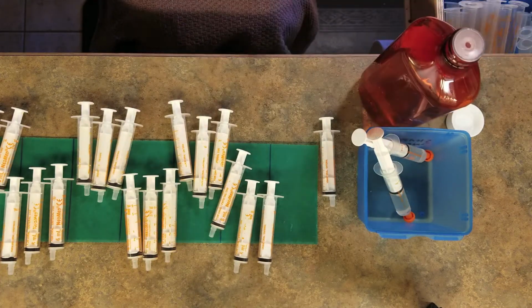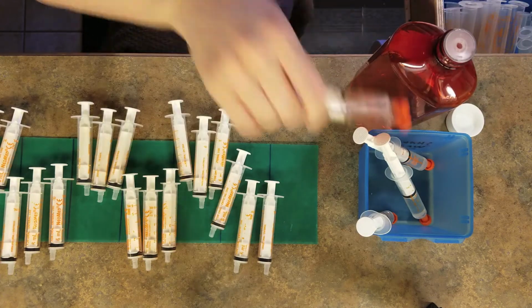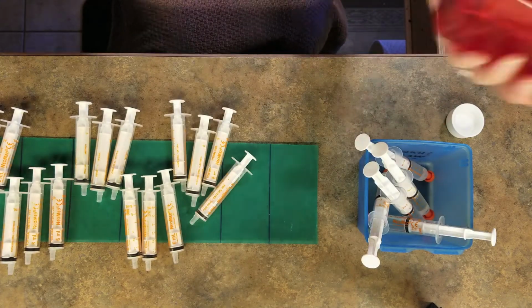So when I do medications, I do 1 medication at a time only. I only have 1 med out. I'm double checking to make sure I'm drawing the correct amount. I also double check to make sure that the bottle hasn't expired.